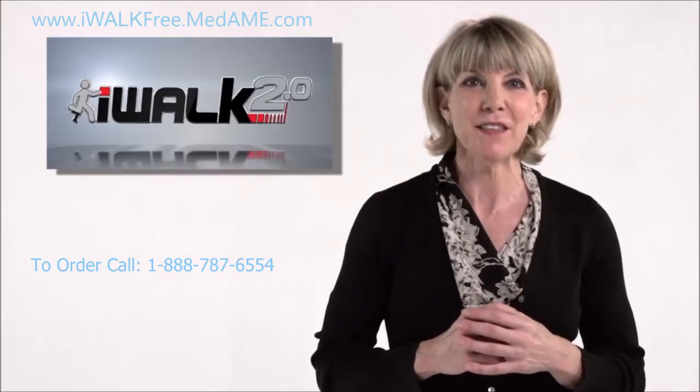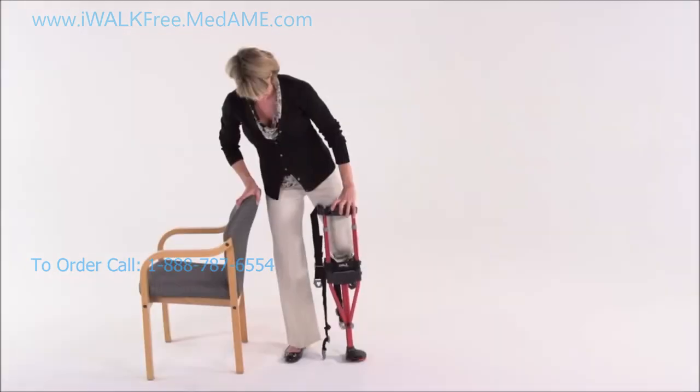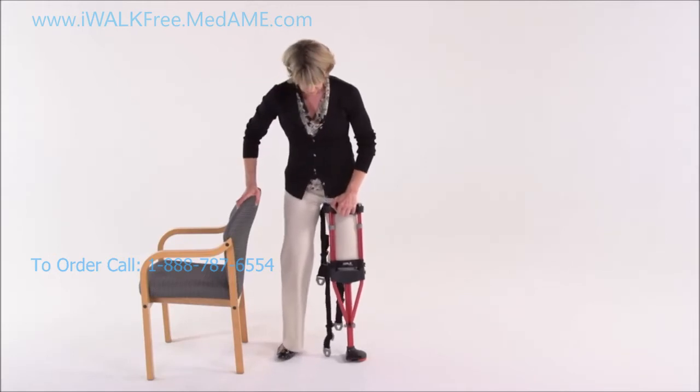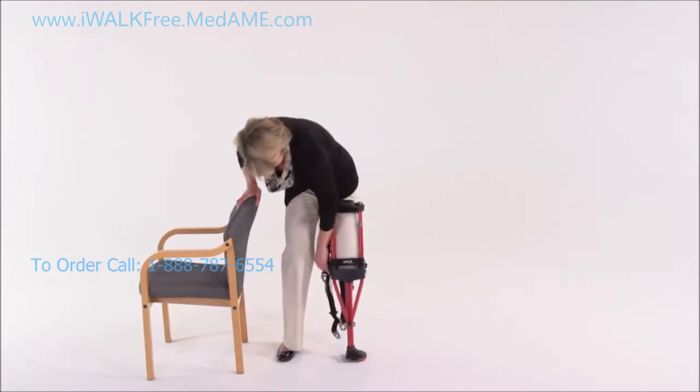Next, you're going to adjust the length and tension of the straps. Start by kneeling on the crutch again, but remember the crutch isn't supporting you yet, so keep a good grip on the handle and position your feet properly.